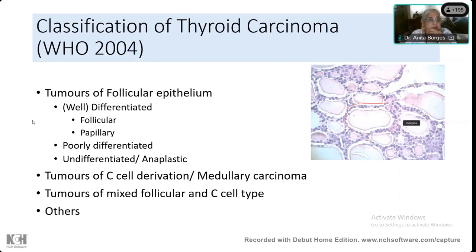I can see he's made a red mark, but he's made it extremely thin. Okay, this is what you showed, right? Yes, ma'am. So all these. Now, can you describe those follicular epithelial cells? Describe them. You know what is the meaning of description, right?